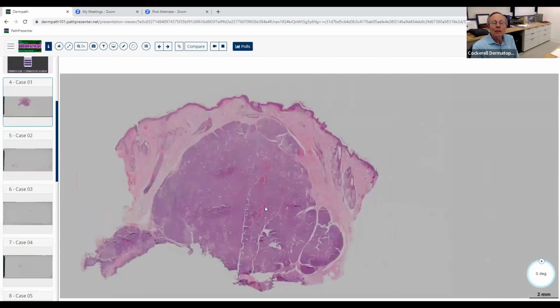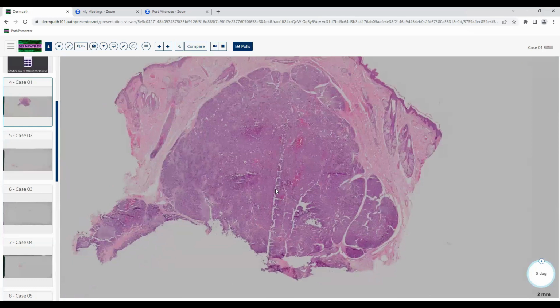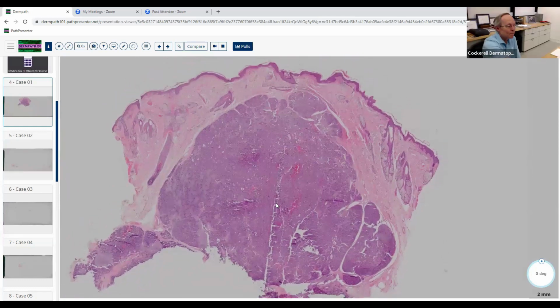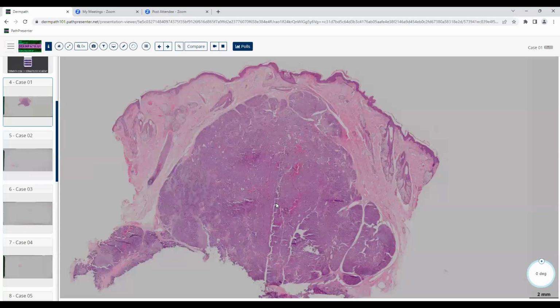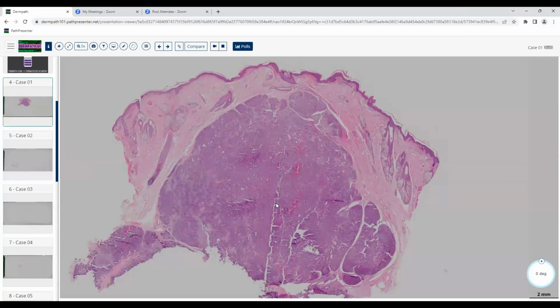Okay, so anybody want to get this one started off? Good morning. I can do this one. Okay, good. So this looks like either an excision, maybe an enucleation. And the lesion looks neoplastic to me. Good. It looks pretty well circumscribed, so I would say that it's benign.